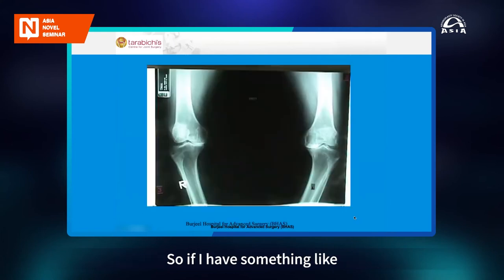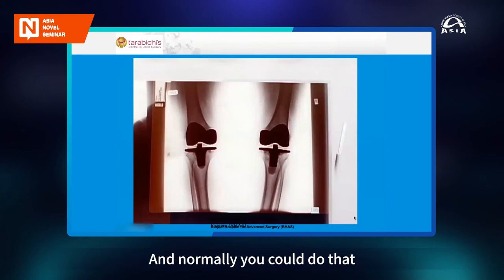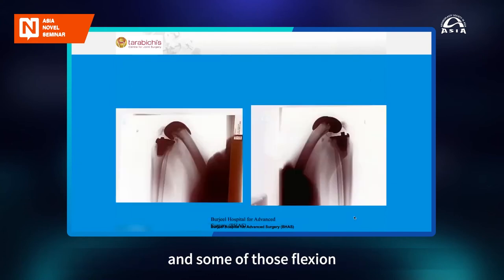So if I have something like that with a varus deformity, I insist that I want to do both knees together. I'm not going to do one and then do the other one. And normally you could do that, and you could obtain full flexion like you could see here.